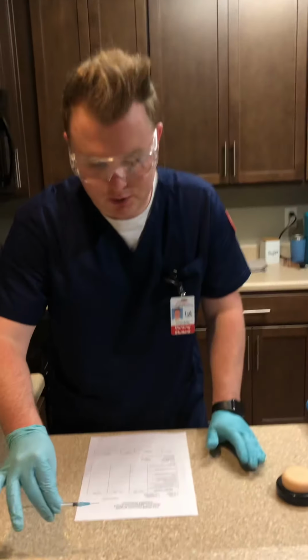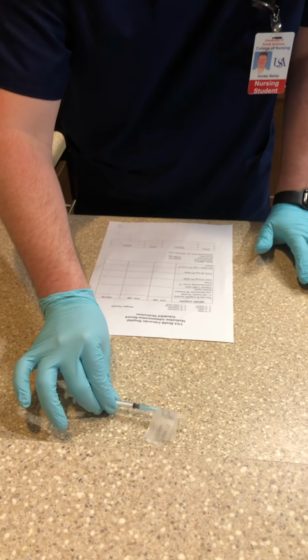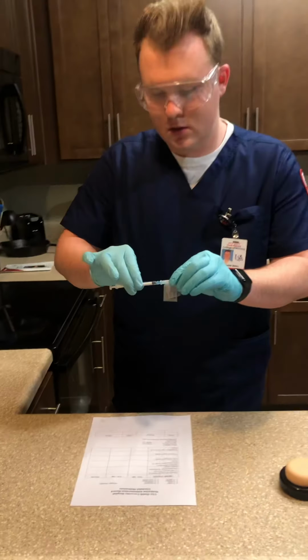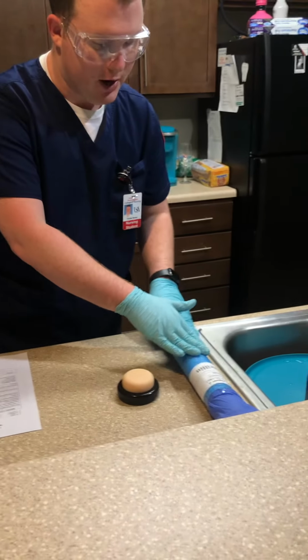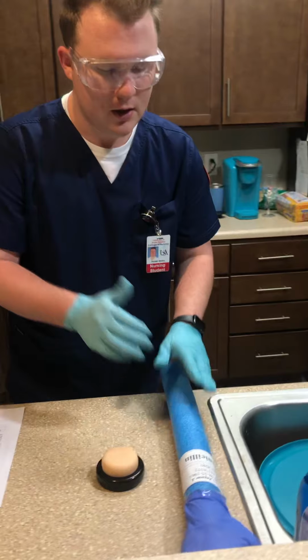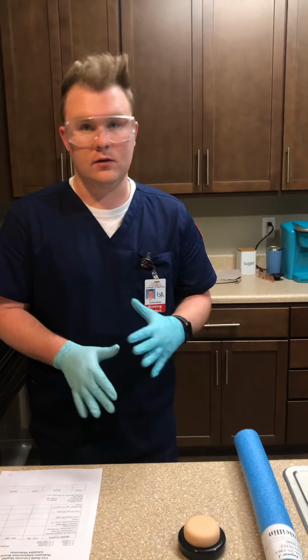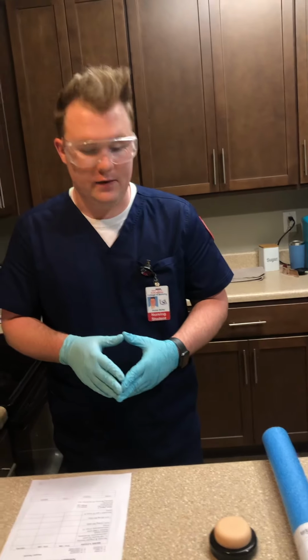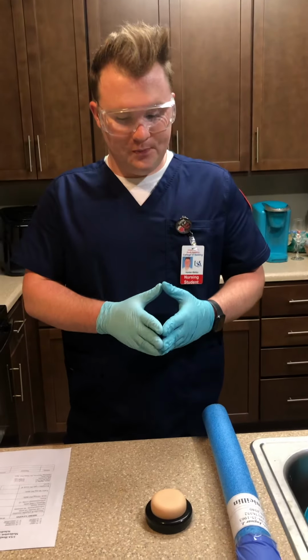And I'm going to scoop, because we never recap. I'm going to place this in the sharps. Now I'm going to assess for comfort. Are you okay? Are you comfortable? Is everything good? Good. So now I'm going to assess for any allergic reactions that the patient could be having, and he is not having any allergic reactions.